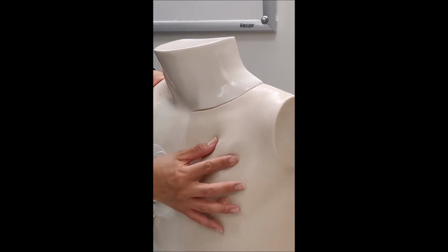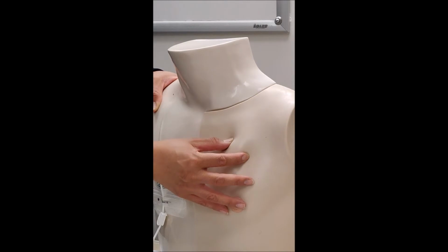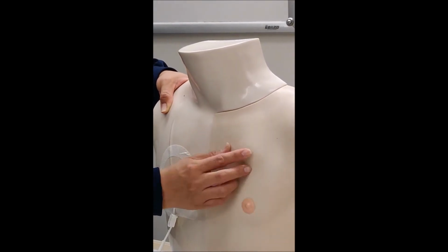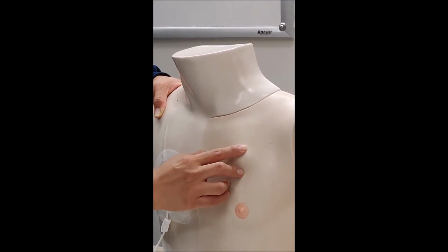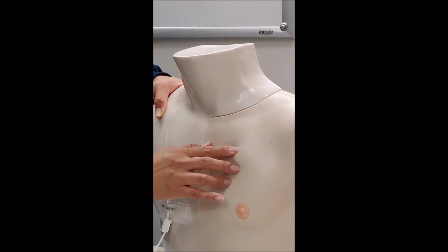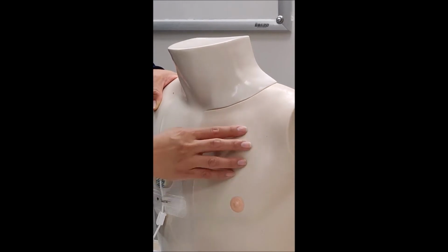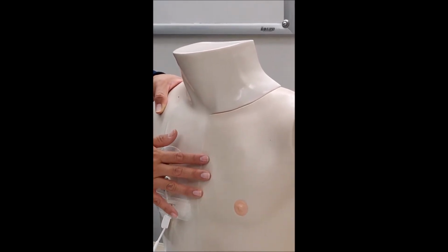The other thing too is, how do you know that you have a regular Cath versus a power Cath? On the power Cath, when you're palpating the top of the port, you're going to see like 3 ridges at the edges, and it's very noticeable, so you'll be able to tell that there's a difference. And what's the difference? You will need heparin at the end.